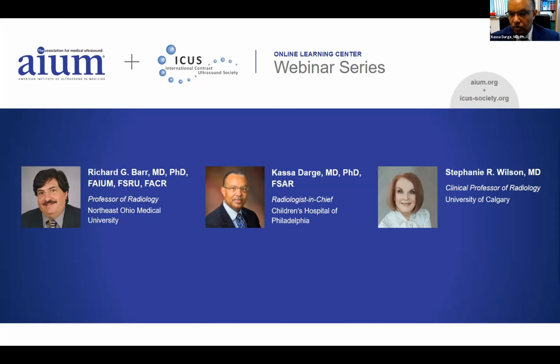Now, the first question that came in, we'll just deal with quickly. From an anonymous attendee: do you generate quantitative analyses with time intensity curves on CEUS studies? I can address that first of all, and I know Richard and Kassa will both address this as well. Time intensity curves and quantitative analysis of CEUS is a very big thing and has its own committee in QIBA from the RSNA. One of the ongoing problems with doing these quantitative analyses is that there is a difference between manufacturers in the result that we get.